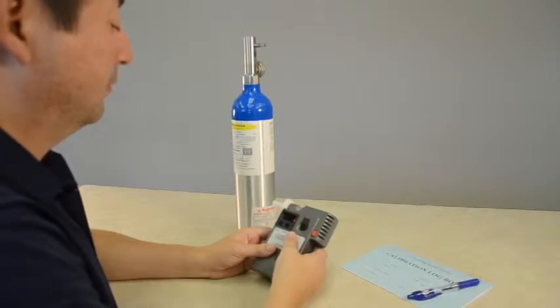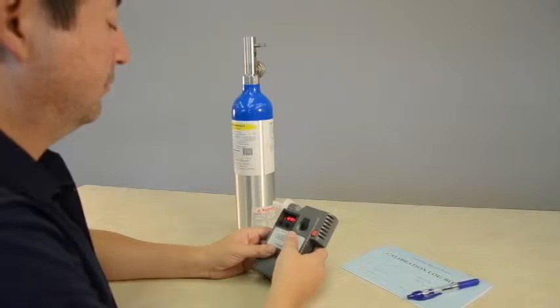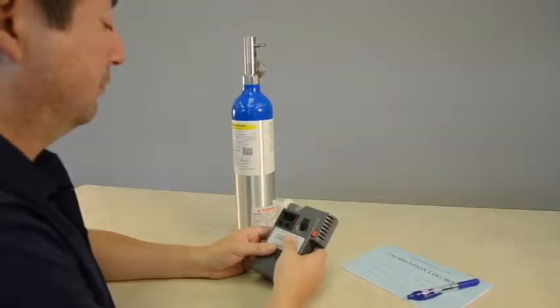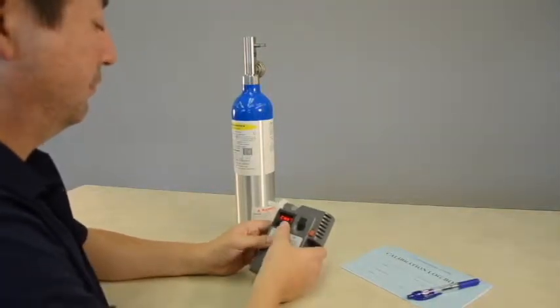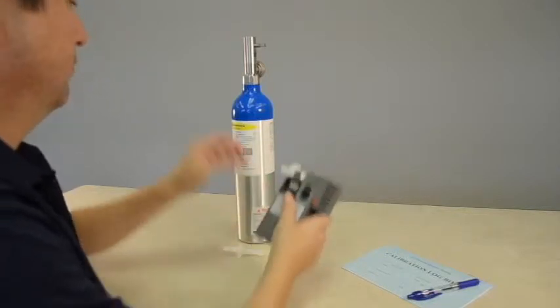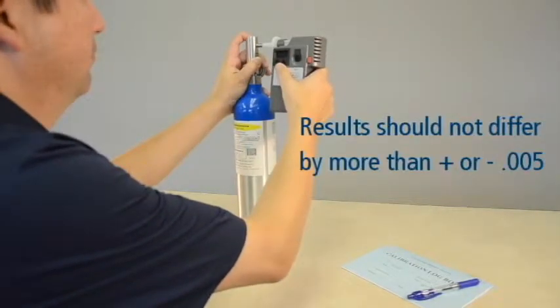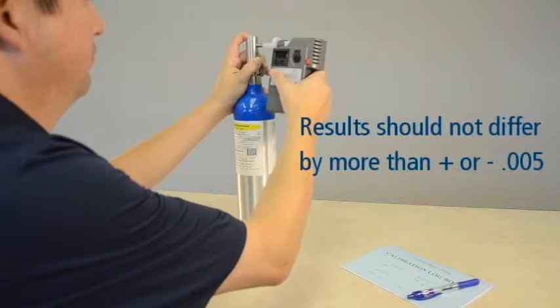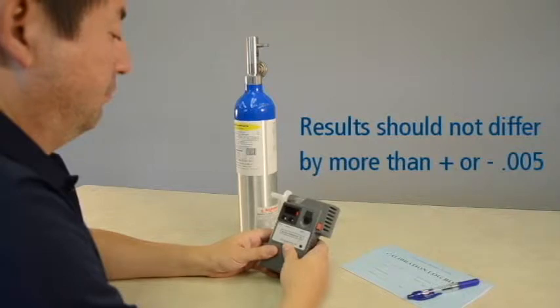An accuracy check is a test of your instrument's ability to read a known alcohol standard within a given tolerance level. For those of you doing DOT workplace testing, we recommend reading the manufacturer's quality assurance plan to understand how often accuracy checks must be performed, the acceptable methods for performing an accuracy check, and acceptable tolerance levels. The result of your accuracy checks should not differ by more than plus or minus .005 from the expected value of the standard gas sample.